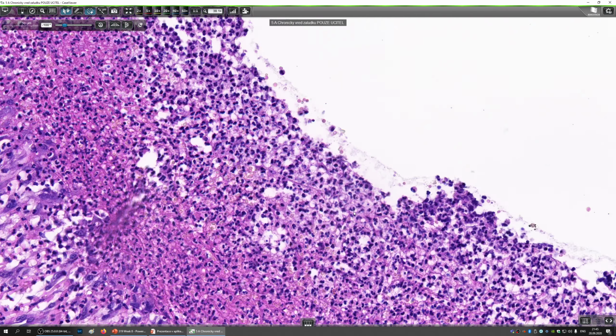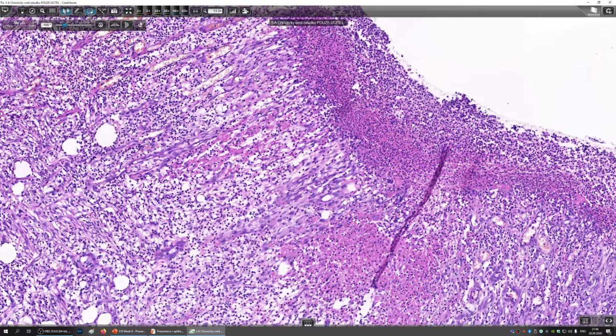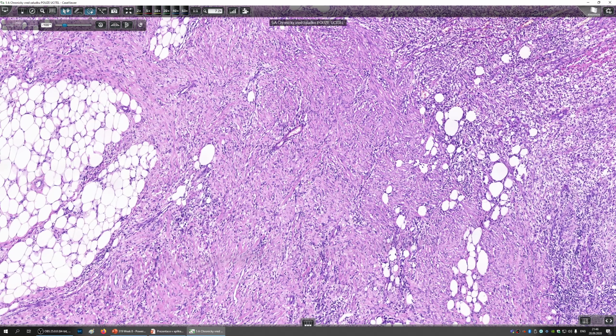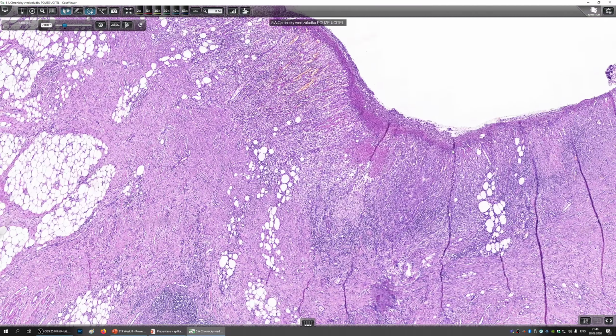Here are some neutrophils. So this is the bottom. Then below this exudate, below this debris, you can see the non-specific granulation tissue. This is the thing which happens when the organism is trying to heal itself. So granulation tissue is the universal healing tissue, and if it goes well, then the granulation tissue matures into scar. So here you can see a lot of scar tissue, but unfortunately the process, the chronic inflammation, couldn't be really stopped by the attempts of the organism.